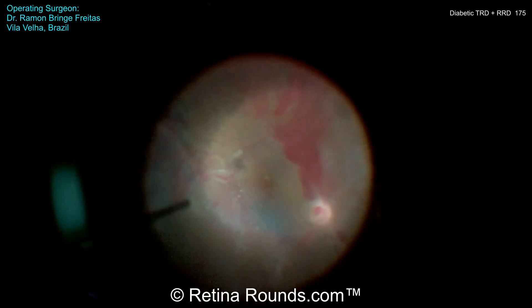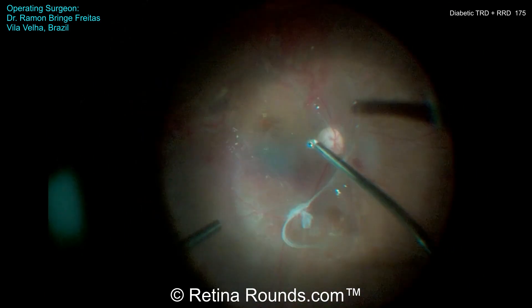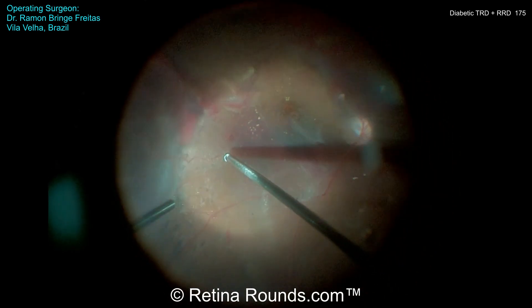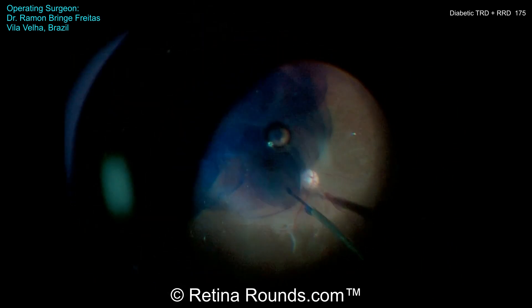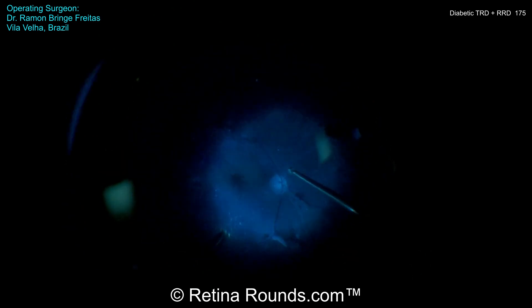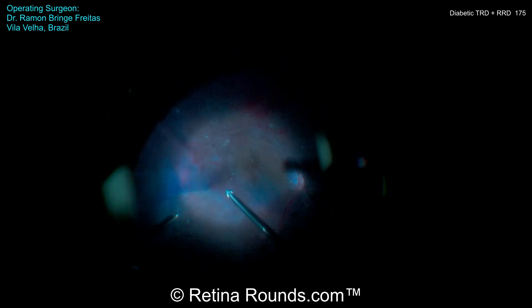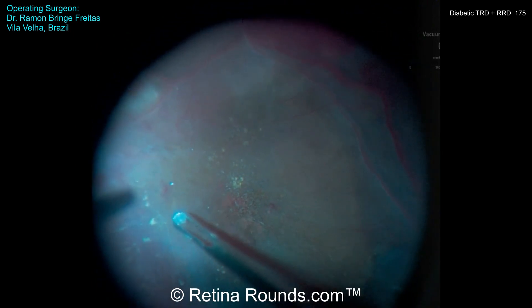Not seeing that elevation, he's instilling some triamcinolone to better visualize the posterior cortical vitreous. He's now removing the bulk of that triamcinolone. We're not seeing much staining over the posterior pole — he's trying to aspirate and engage an edge of the vitreous, but just not seeing it. So now he's going to instill some tissue blue and is evacuating that to try to stain some of the posterior membranes and also potentially some of the posterior cortical vitreous. He's removing that tissue blue and has now switched to a high magnification view, using ILM forceps.